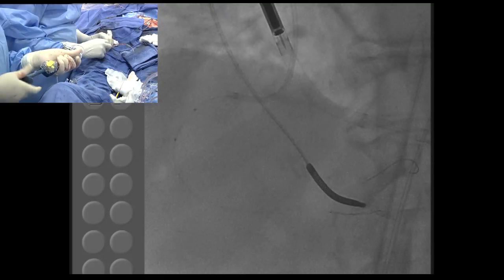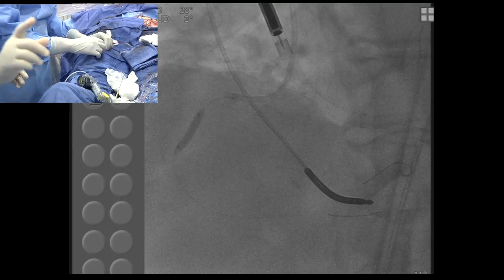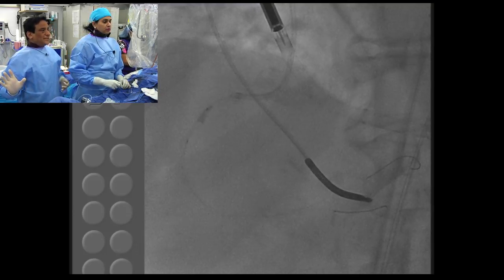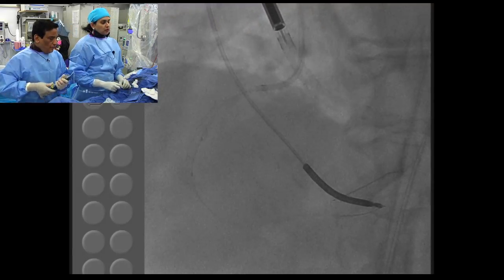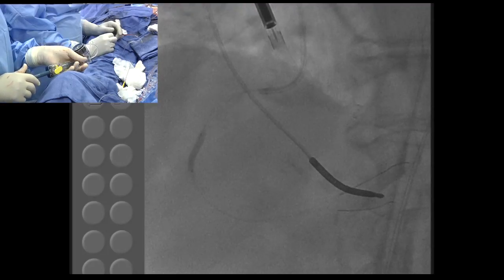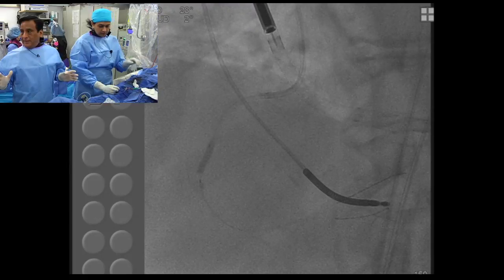Samin, what do you think have been the larger enhancements in the Impella catheter? I would say basically the ready pump, the ready setup. To me, that is the biggest thing so far. And the wire introducer. But the key is the pump priming time decreased significantly. So, a ready-made kit. Now you have no delay.